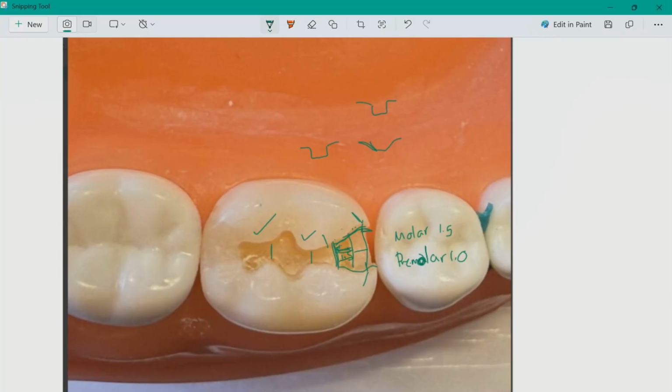Everything else looks great, doctor. I don't have any other kind of notes on this. I do want to say, again, same like with your anterior, once you reach this point and you want to get modifications, now what I want you to do is to just go with a small round burr, and if there's caries here, only remove the caries, make like little round holes and remove the caries, and then you look at it again.